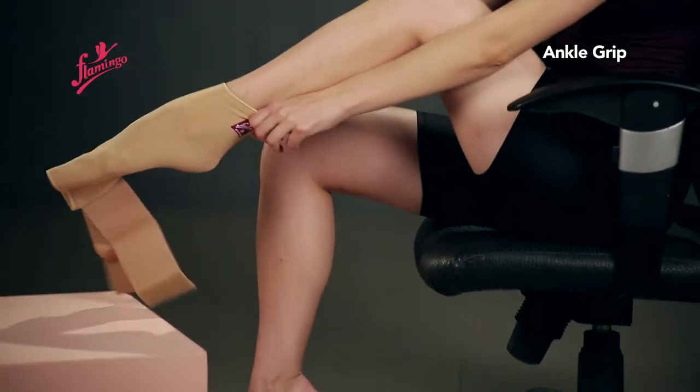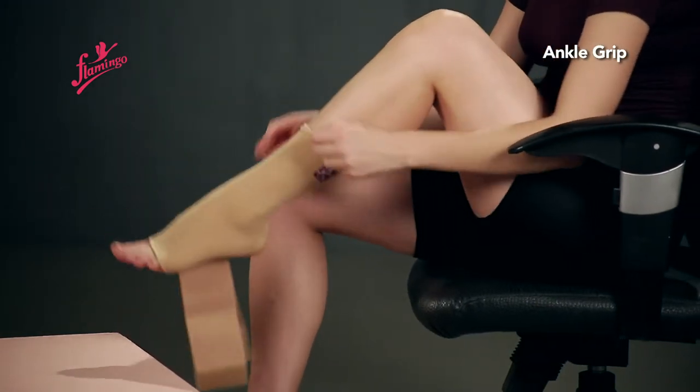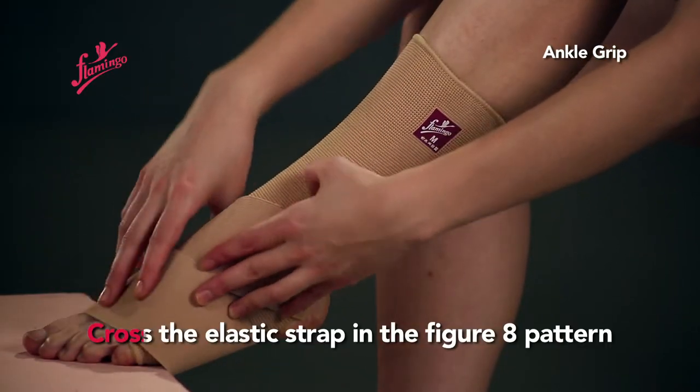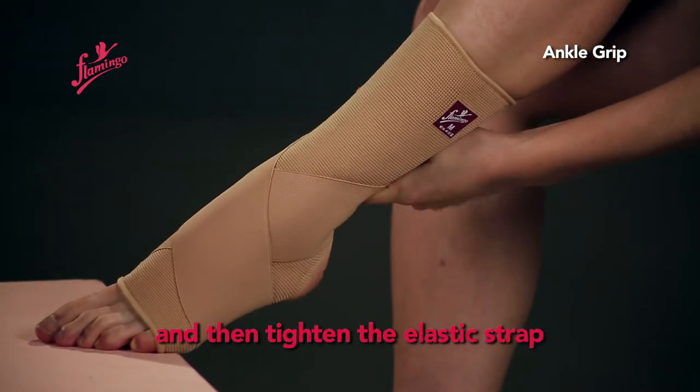Insert the foot and pull the stocking upward slowly. Make sure that the heel is at the center of the heel opening. Cross the elastic strap in a figure-8 pattern and then tighten the elastic strap.